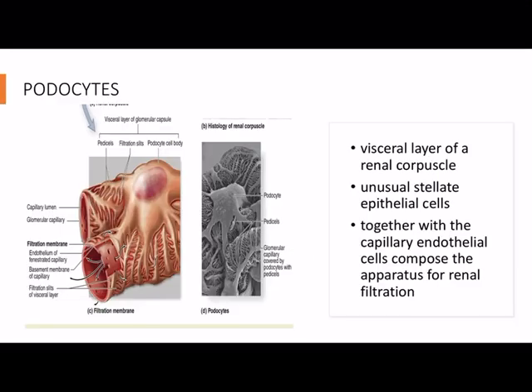So here we have a clearer picture of your podocytes. This is a complete picture of your podocytes, an electron micrograph and an illustration. But you wouldn't be able to see podocytes this clearly under the microscope. This is just an illustration.